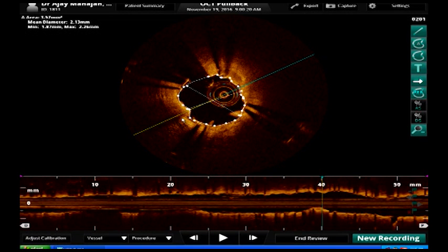On these OCT pictures, I feel comfortable that the stent is good, but you have to expand it a little bit more. My main concern is that to achieve a minimal stent area of 6 square millimeters, or at least 5.5 and above, I can accept. Here it is 3.57. So you need to really go up. Maybe we use a 3.5 non-compliant balloon proximally and make it much bigger. Yes, we will just see the picture and then we'll decide.